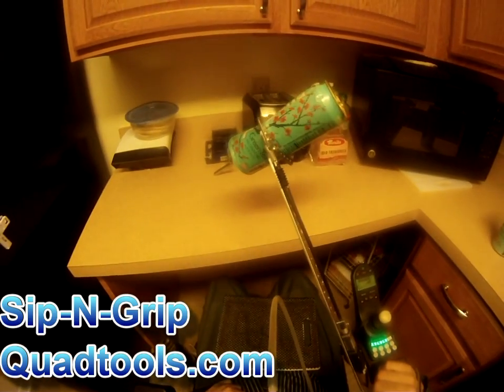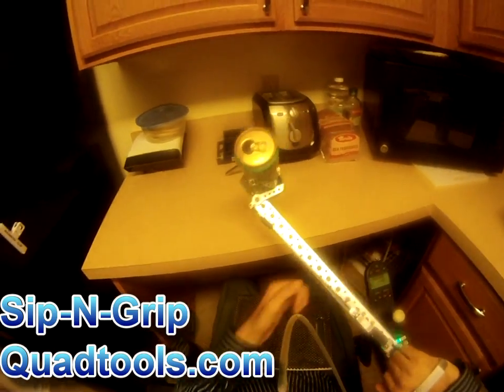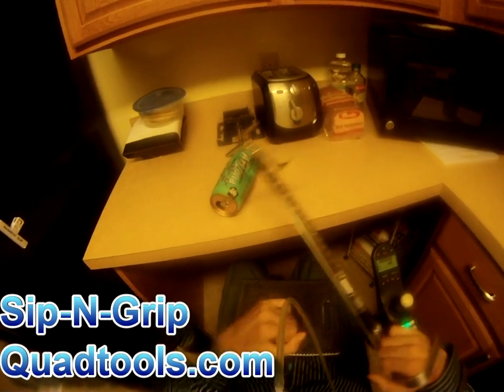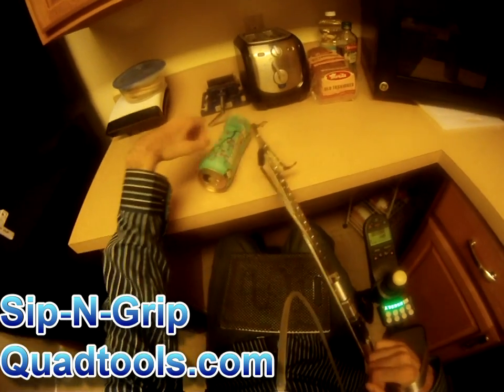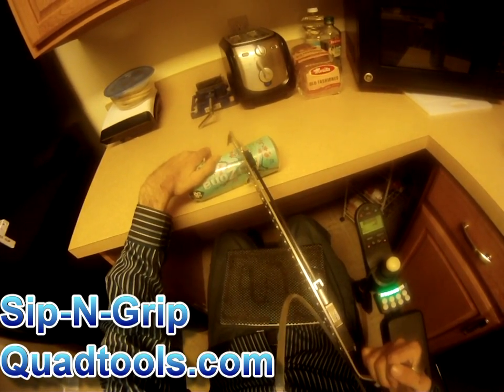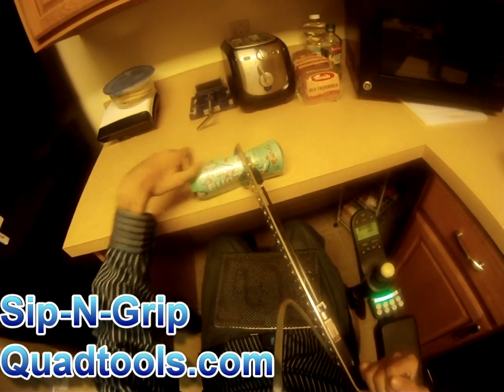As you can see, the reacher has enough power to start to crush this empty aluminum can. With 10 pounds of closing pressure, it's quite a bit — enough to pick up even some demanding items that may want to slip out of the jaws.